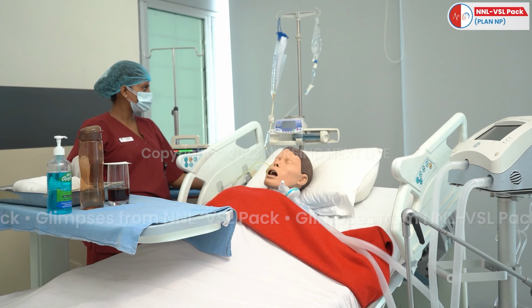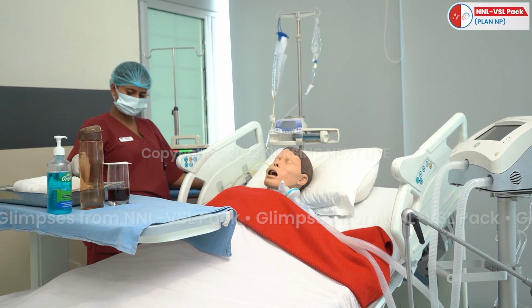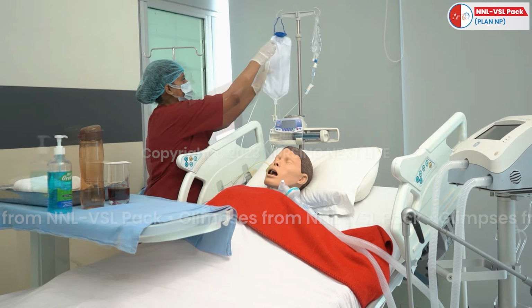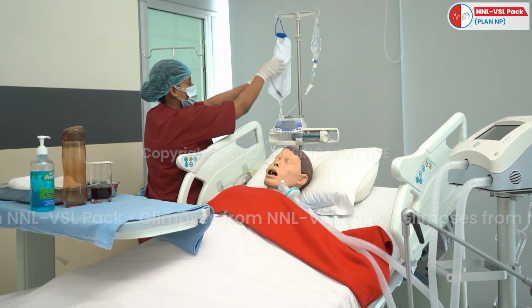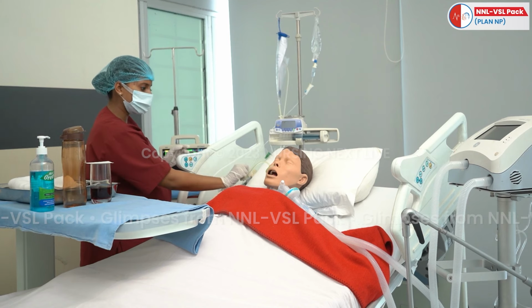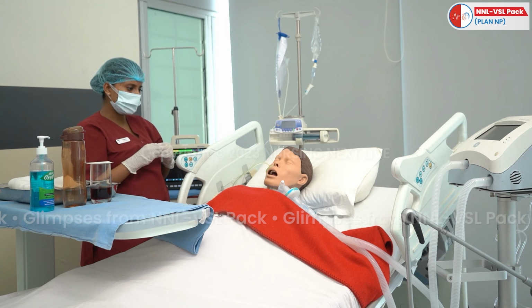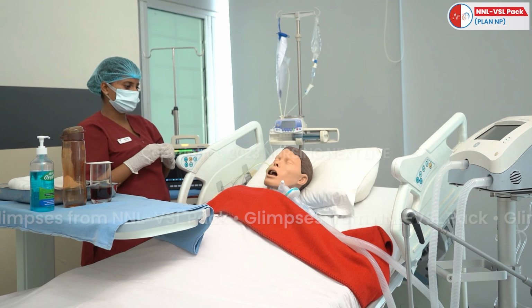Aftercare. First, ask the patient to remain in the same position for 30 to 45 minutes to prevent regurgitation. Okay ma'am, your feed has been completed. You have to remain in the same position for 30 to 45 minutes.